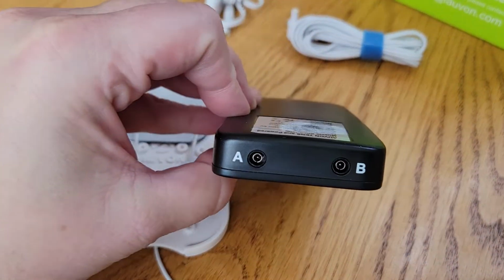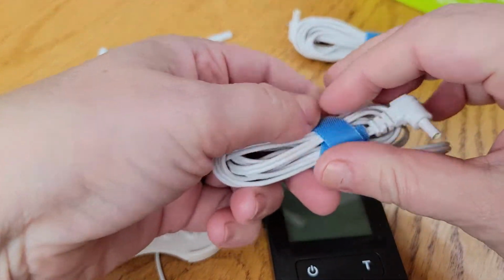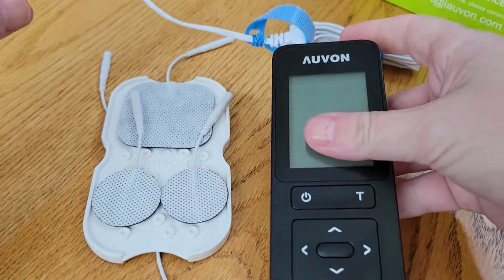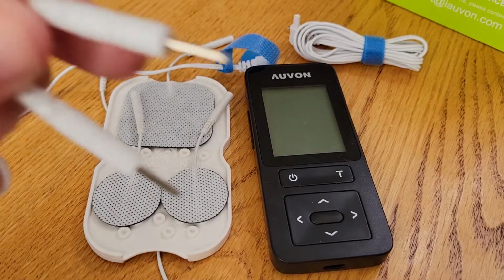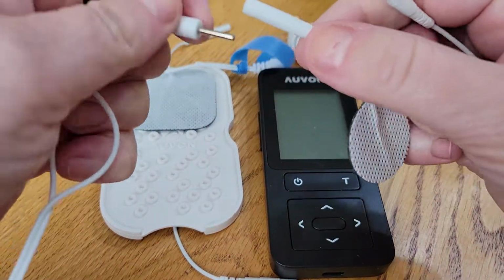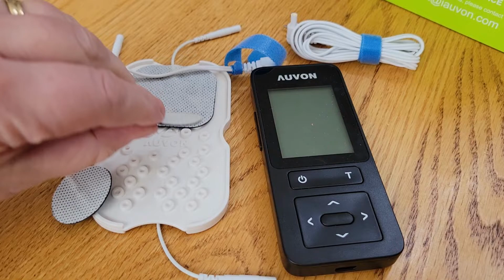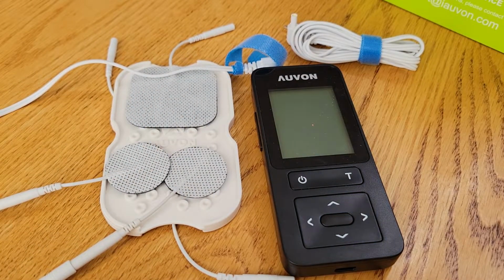And like I said, this one has two outputs, and what you'll do first is take your cord and undo that. And we're just going to put it in this channel up here. And then on the other end of that cord are these two outputs here. We'll just take each of these and plug those in. And then you're going to place those on the area where you want to work. Today I'm just going to put them back here so you can see where they would go. Just imagine them being on a muscle somewhere.